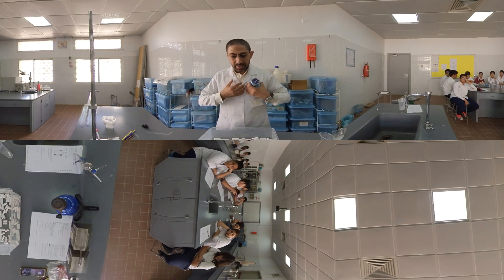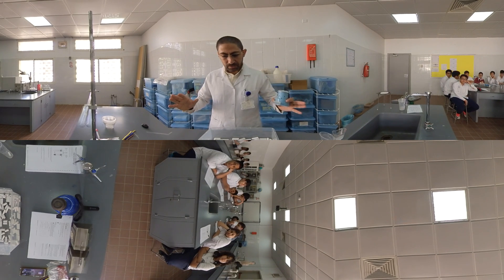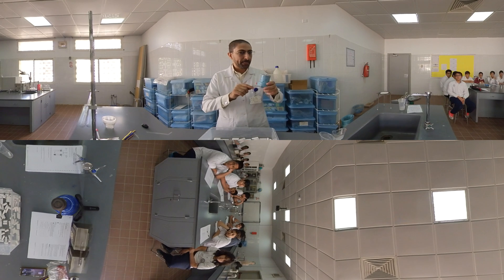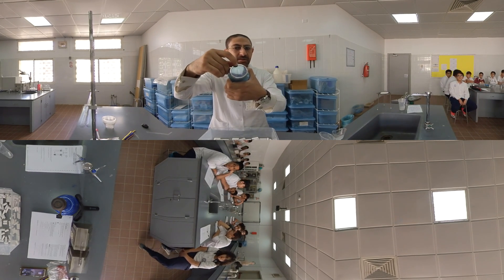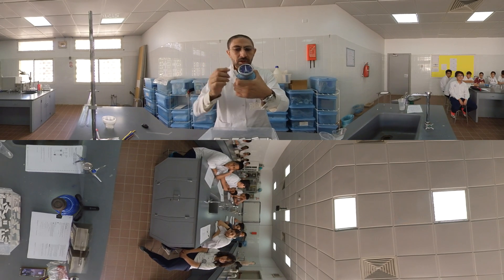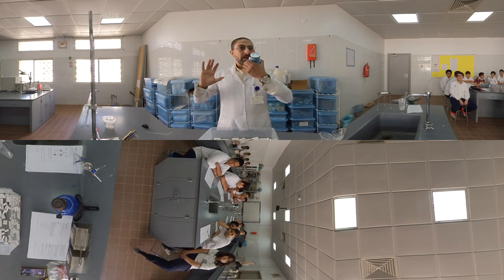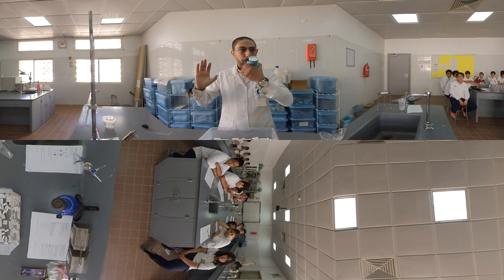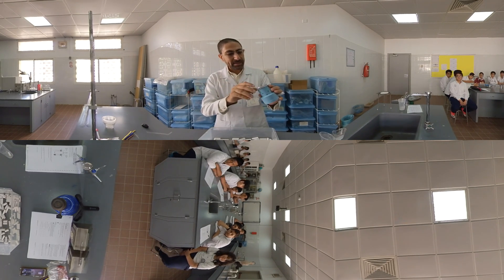First, we're going to inhale a normal breath, then exhale a normal breath into the spirometer. Be sure that the spirometer reader is on zero before you start. I'm taking an inhalation and then exhaling normally — like this. That's it. Read and write down the value.